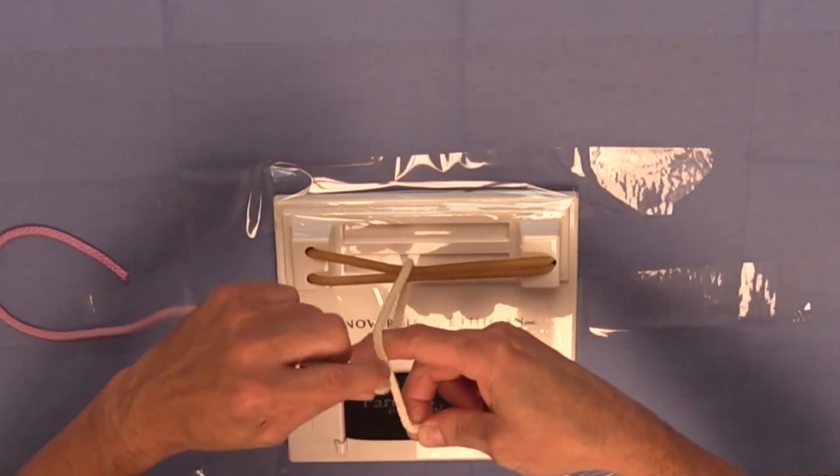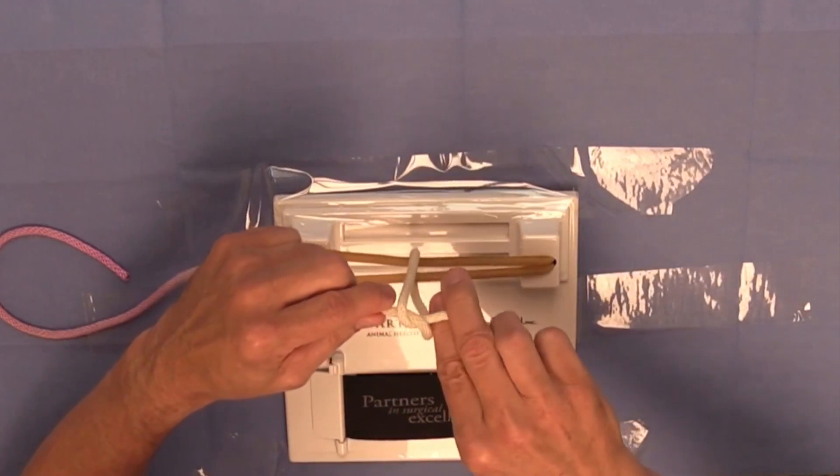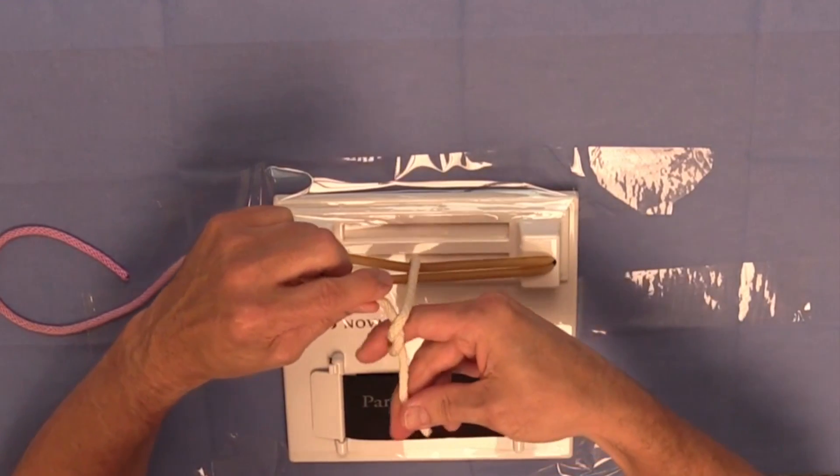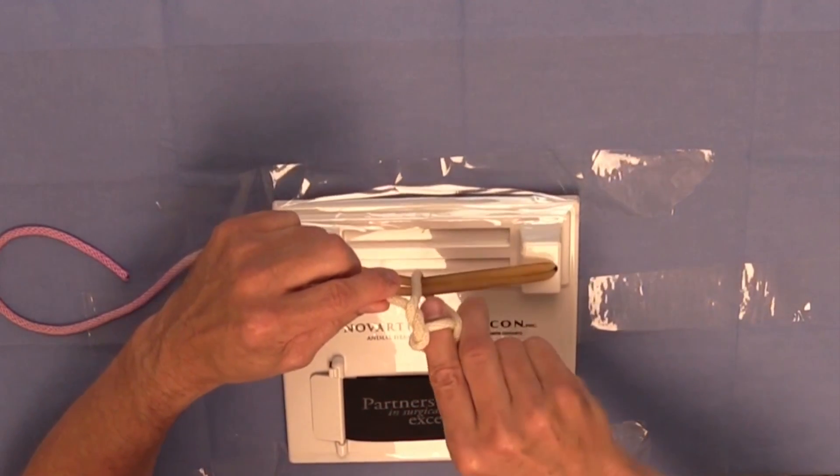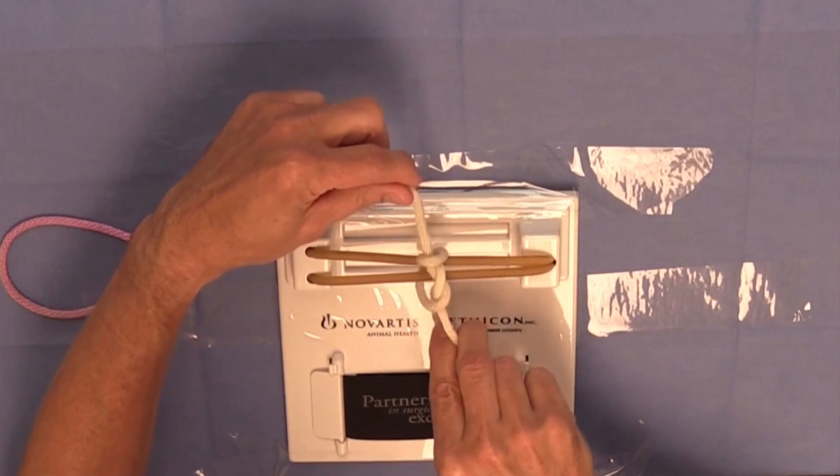I'm simply going to go around. This would be a simple square knot, and then go back through again, twice. Now I've constructed a surgeon's throw.